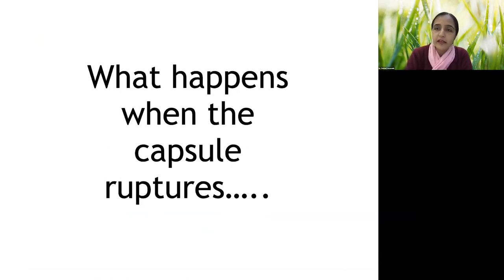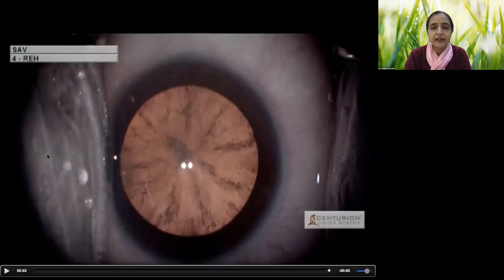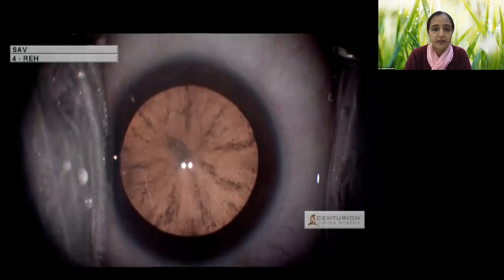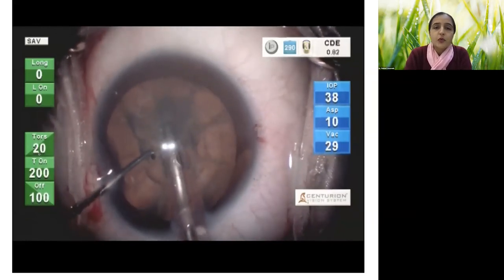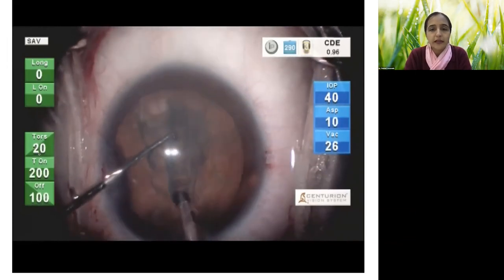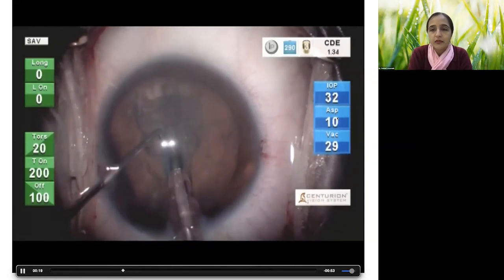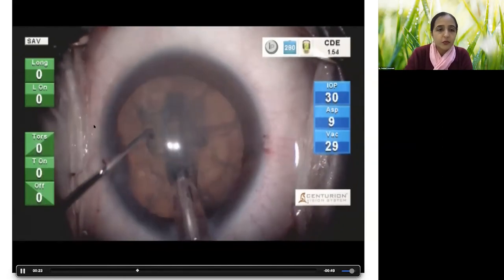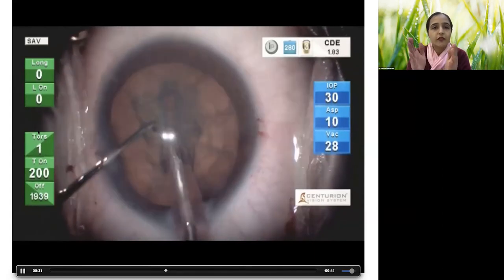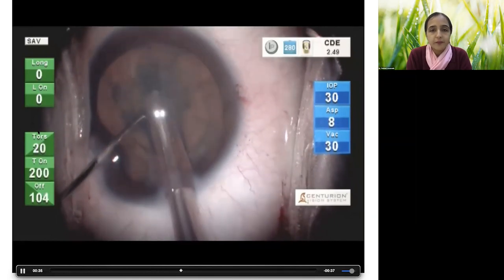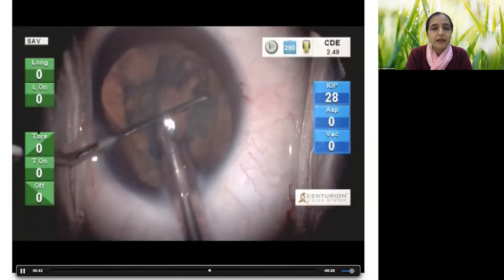What we'll see is what happens when you expect a smooth surgery and it doesn't end up that way — the capsule ruptured. This is a soft, juicy cataract. Our trainee surgeon uses what we call a nucleotomy or modified divide-and-conquer technique: deep sculpting with very low parameters — flow rate about 14, low vacuum, and only 20% torsional ultrasound — because we don't want to cut through the nucleus. The idea is a deep sculpt so horizontal separation of the hemi-nuclei becomes easy.